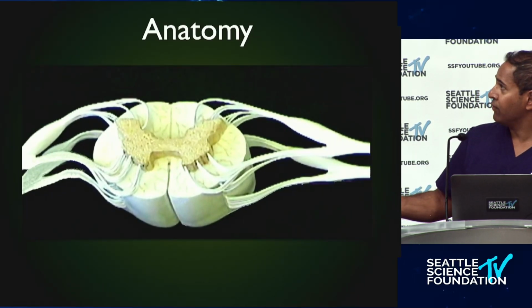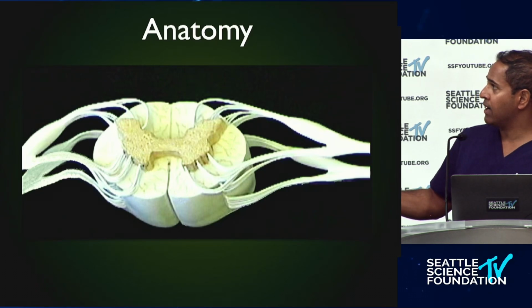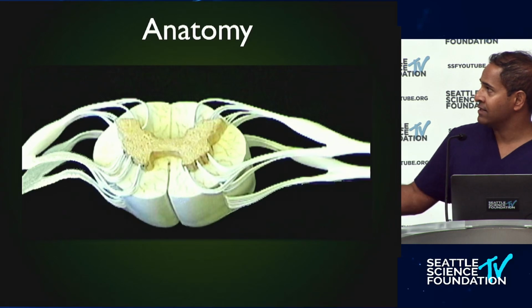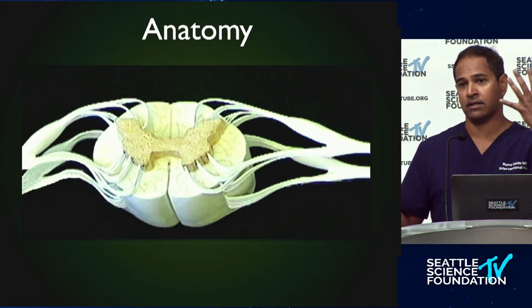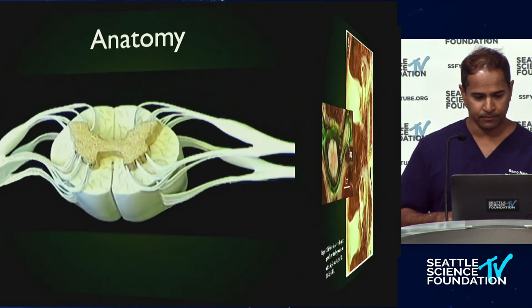So the DRG itself is this bulbous structure in the paraspinal tissue. It is the cell body of the somatosensory afferents coming from the periphery. So basically, the cell body of every single nerve going out to your periphery comes through the DRG. It has a unique pseudopolar T-junction where basically a neuron comes in, up to the cell body and back down. The mechanism of action theory is that DRG stimulation provides a new filtration effect on nociceptive input. And that's why we see the improvement in symptoms.